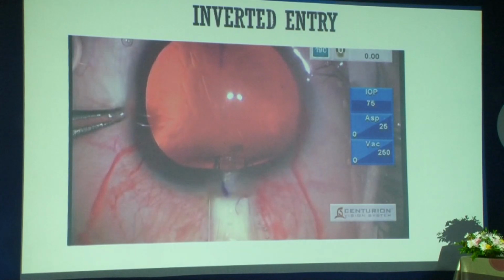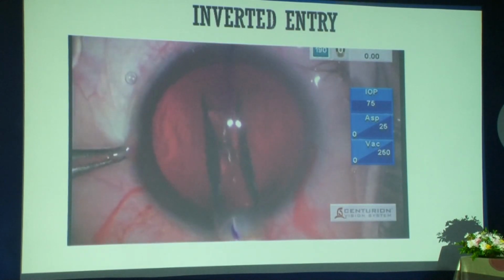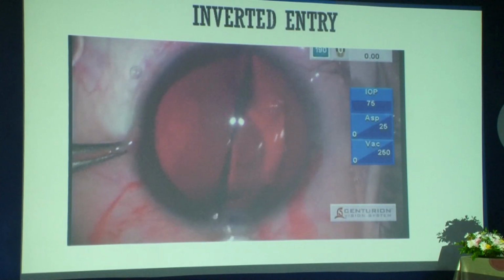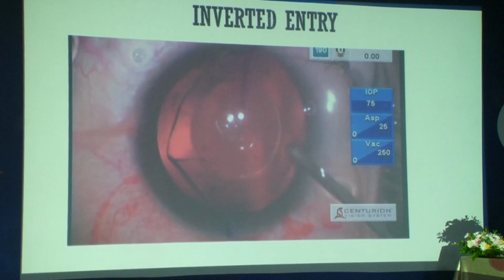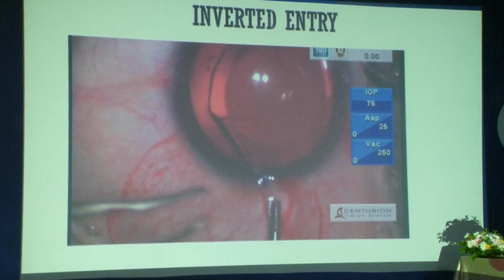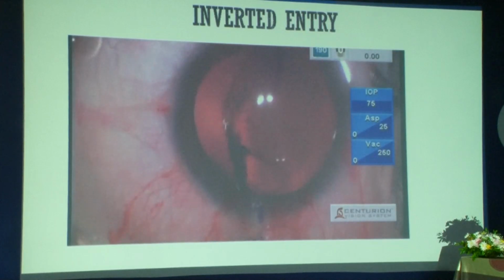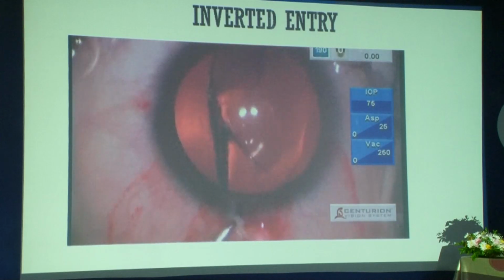So this is part of the video that Dr. Ridhima was showing. You can see that instead of a reverse taco, it opens like a classical taco. Instead of using a second instrument, she uses a viscoelastic. But again, as shown in the video, taking it out is not at all difficult. You just enlarge the wound a little and very gently keep tugging at it.